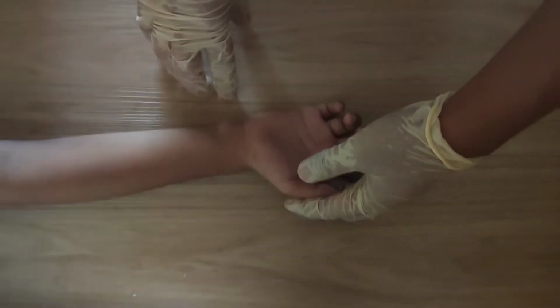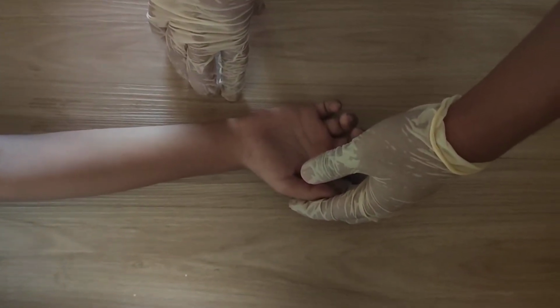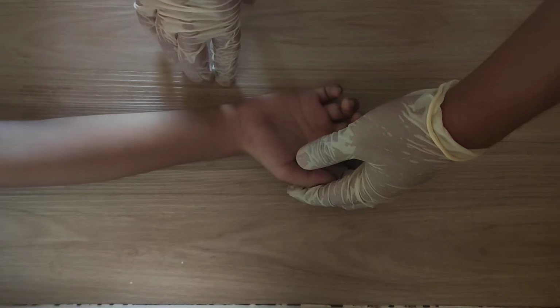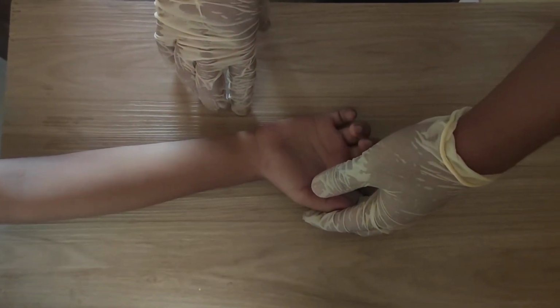Okay, before we proceed to another procedure, let me just remind you that I'll just be doing this, just to check the pulse of the patient. But in getting the sample, I'll just be using the cucumber.